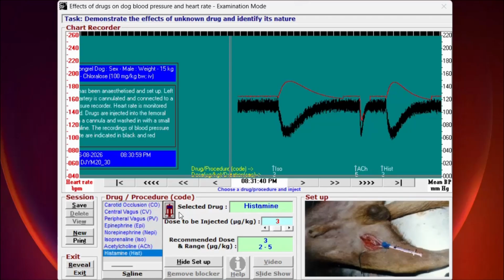When you are giving low dose epinephrine, only the highly sensitive receptors, that is the beta receptors, are going to act. So only beta 2 gets activated, and as a result it causes vasodilation, whereas alpha 1 is not active in low dose. So in that case we are going to get what? Vasodilation, and leading to that there will be decrease in the blood pressure. So we are going to give a lower dose of epinephrine.